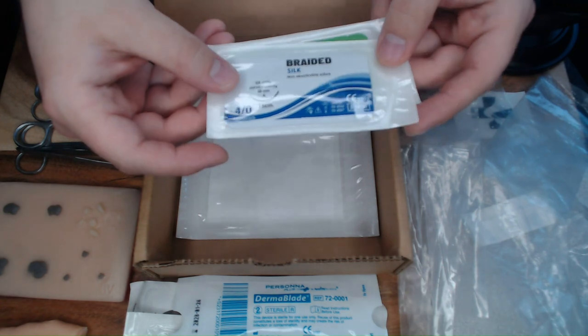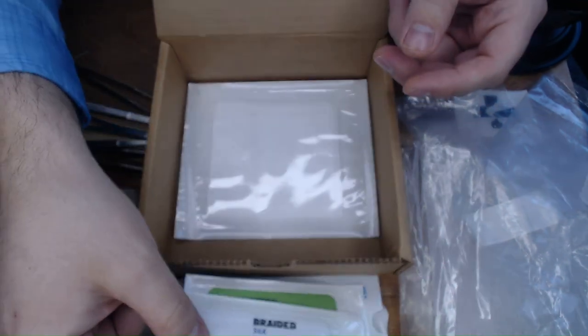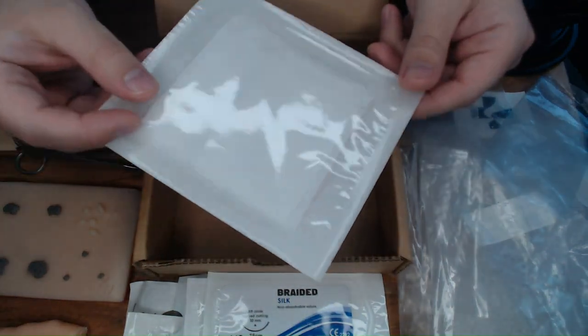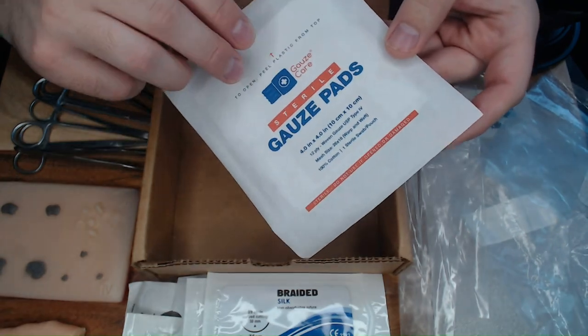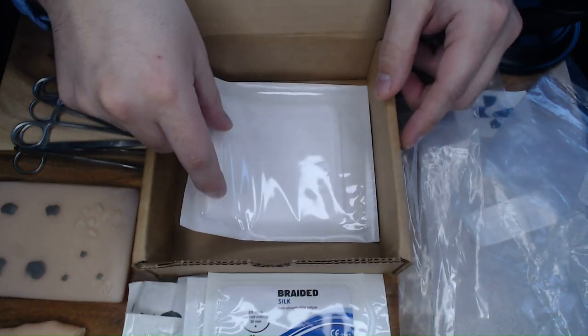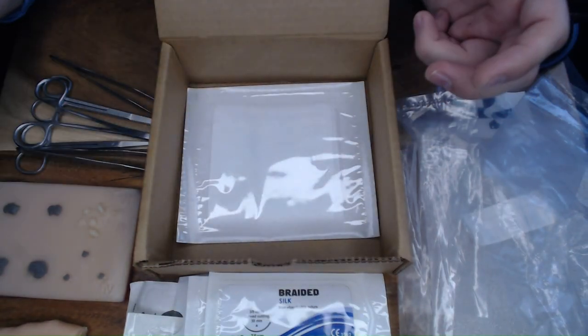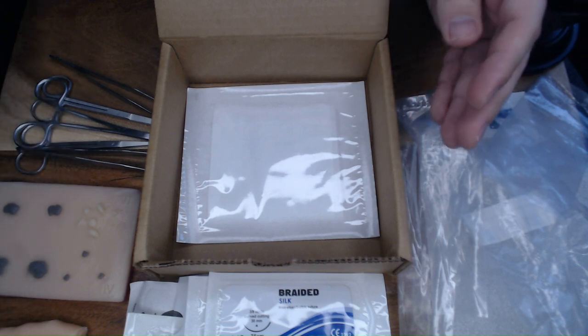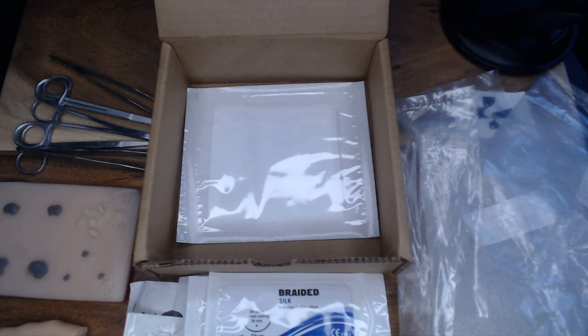We'll always include suture for you to practice with. The last item is a 4x4 gauze to help with paronychia technique, anesthetic technique cleanup, and just having extra supplies on hand. That is our kit — between the molds and the instruments. Like, share, and follow. If you have additional questions, reach out via the comments section or email me directly at jim@pulaskiandassociates.com. Thank you.